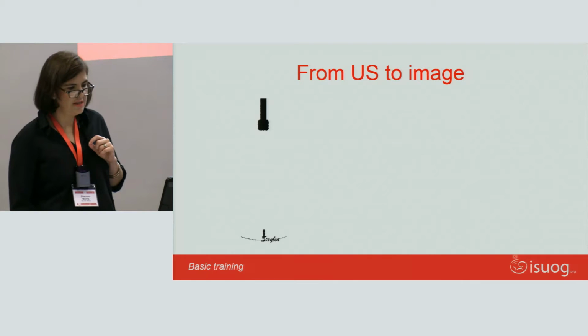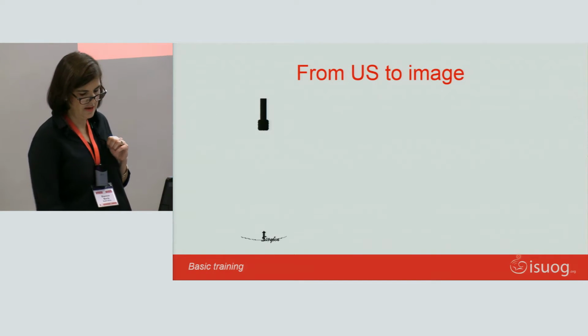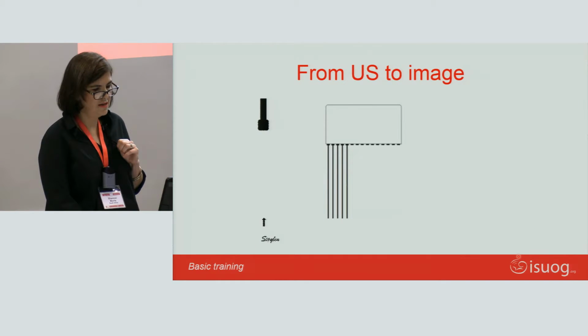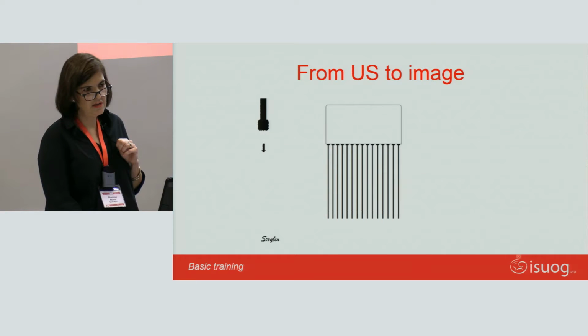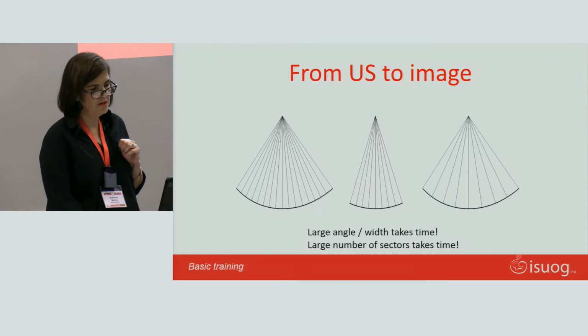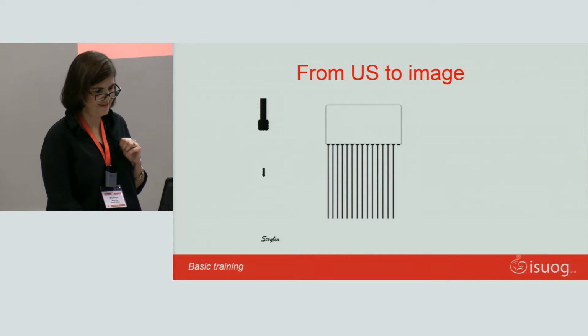So here you can just see this depicted again. The ultrasound beam is being sent into the tissue. It gets reflected. And if you put many of these dots in a row, in a sequence, many signals being sent out, it results in the production of a picture.